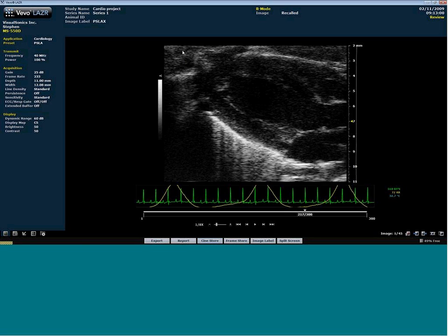You really have to work to optimize the image settings. So cardiology presets are normally going to have standard line density, and they're also normally going to have one focal zone. That's going to drive the frame rate up. But with the 250, with the 21 megahertz probe, you're going to be dancing right around the edge of 100, 110, 115, 120 frames with just the basic settings.